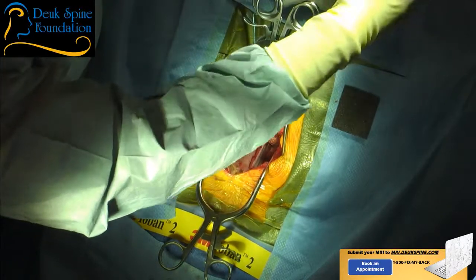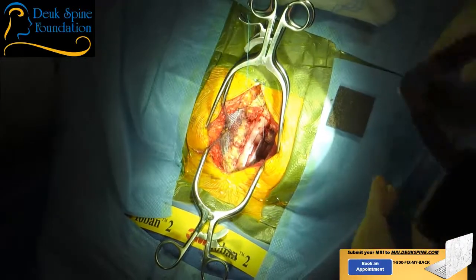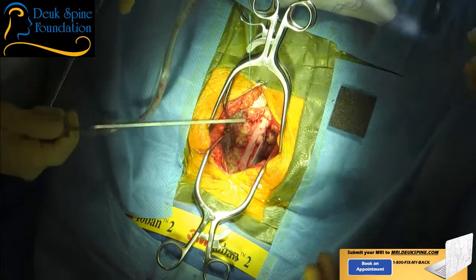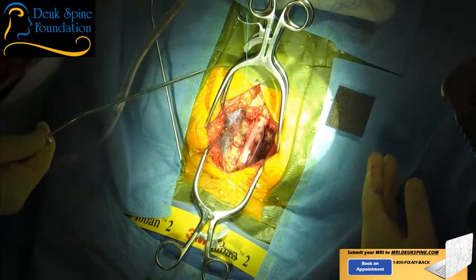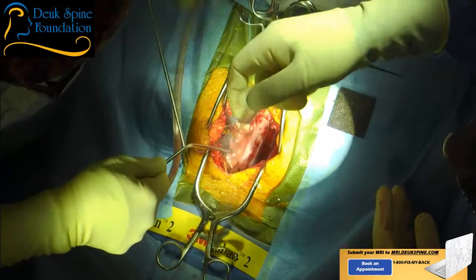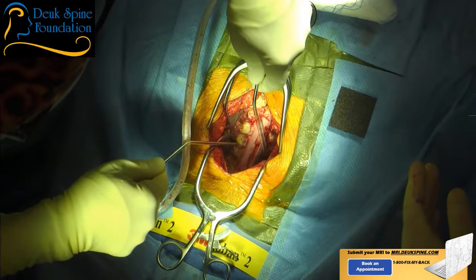Yep. It's much safer for the patient. It's much safer here during the surgery because it allows the surgeon to focus on what needs to be done rather than hemostasis. I need irrigation first. And then it's better for the patient because you're not losing blood, so they have an easier recovery, right? They got all their hemoglobin they need to oxygenate their wound and get nutrients and stuff.